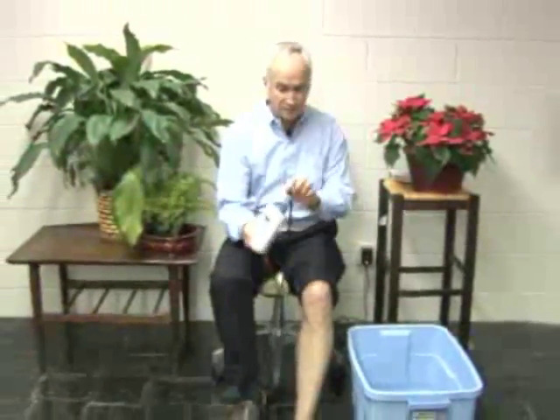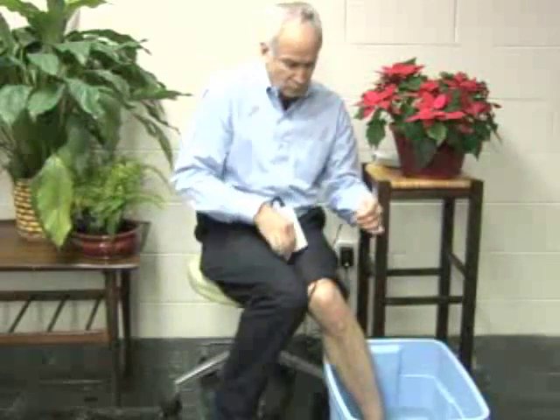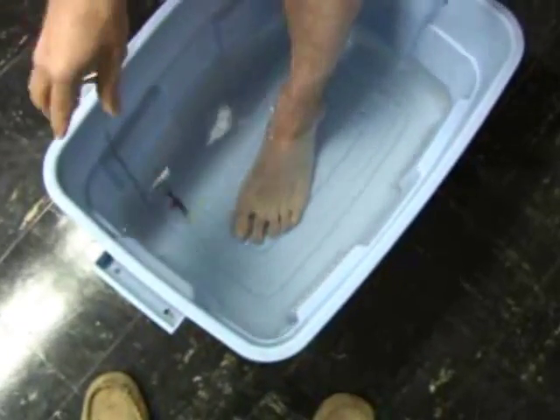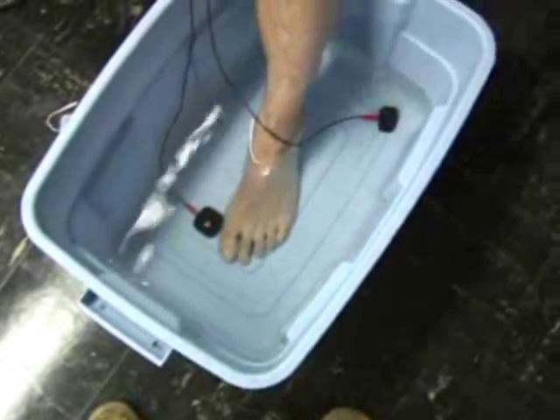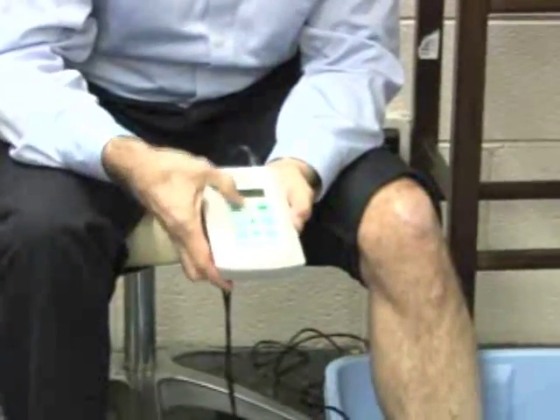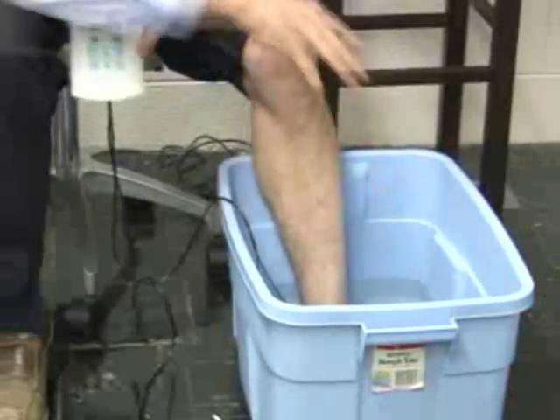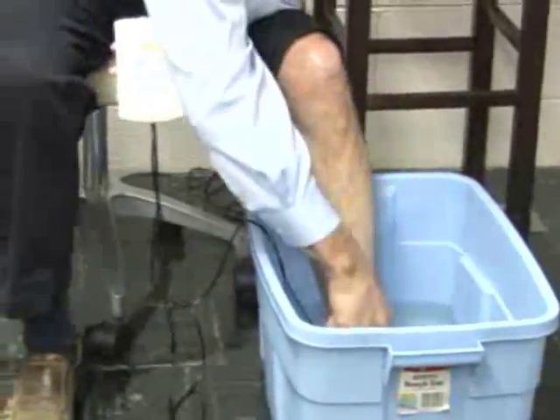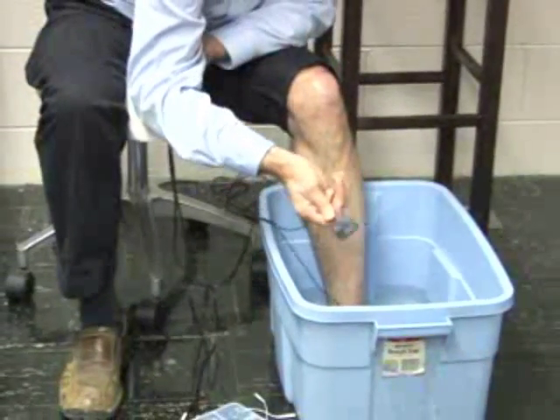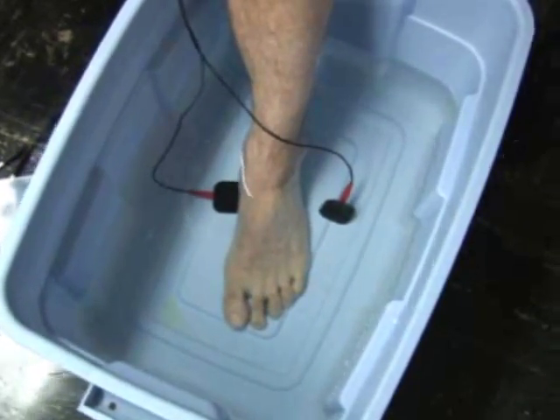Literally what you would do — again, without the unit being plugged in, only operating on batteries — put your foot into the water. Now what has happened is every bit of that water has become your electrode. So we would take one electrode, put it on one side, just drop it. Take the other electrode, put it on the other side, just drop it. When you turn on the unit and start increasing on the channel to increase your power, what you're really doing is right there in the water — everywhere it's touching you is conducting electricity. So instead of having an electrode that only touches a small area where you're hurting, everywhere the water's around your foot is where you're feeling the sensation.